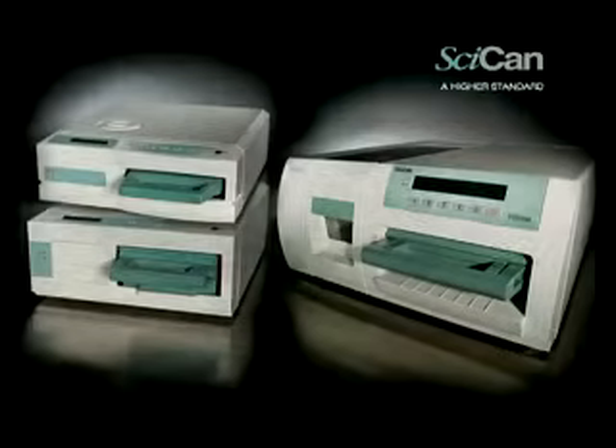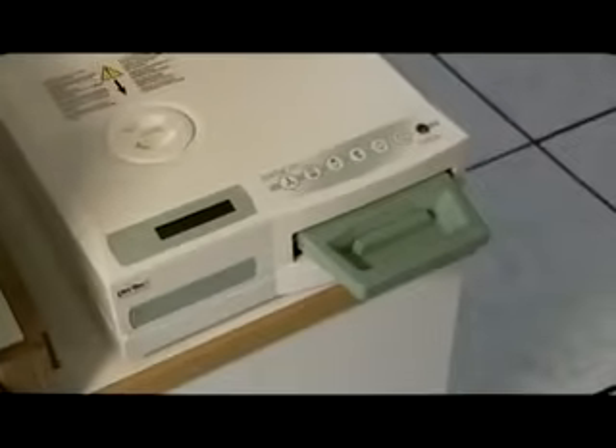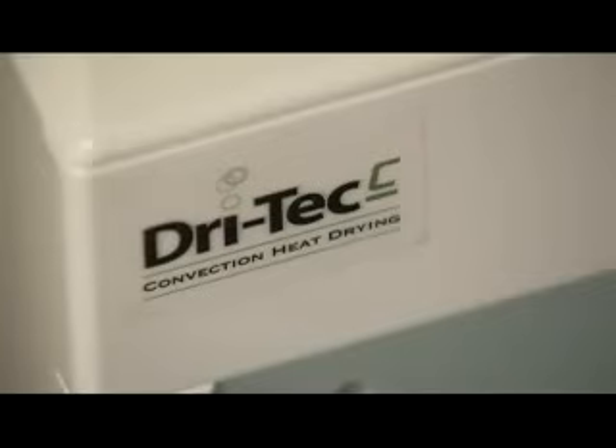Let's take a look at DryTec. The Statum 2000 is the world's favorite handpiece autoclave. It uses convection heat to dry instruments. DryTec C captures the remaining heat in the system after the sterilization phase and releases it into the cassette.